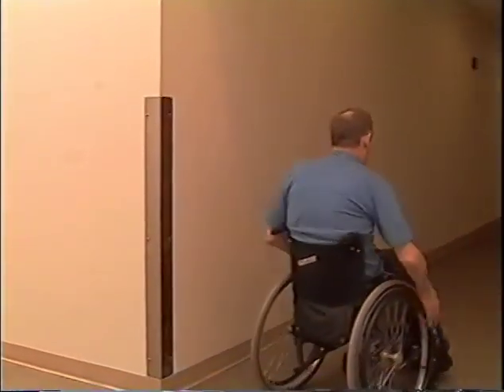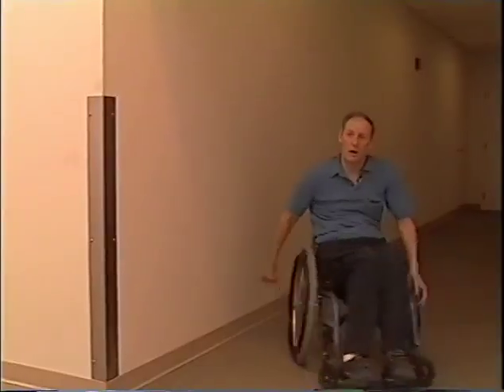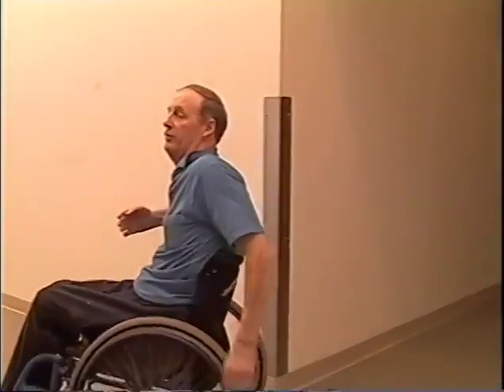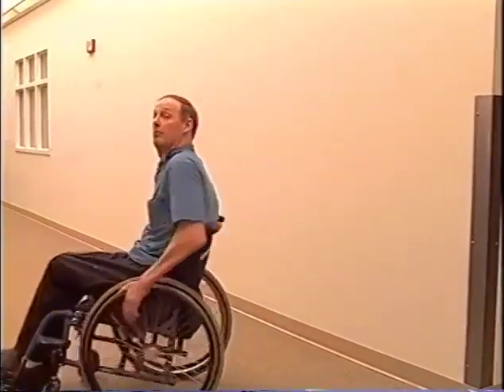All the techniques for cornering are basically the same for the quadriplegic as for the paraplegic. If you are having trouble, if you don't have complete triceps and can't get your arm to extend behind you for cornering, then you can use your elbow. So just the same wheeling, put your elbow out, and it will help you spin around the corner. Just make sure the corner is not too rough and it doesn't abrade your elbow. That would be the only thing. But you can corner just by using your elbow and your shoulder.